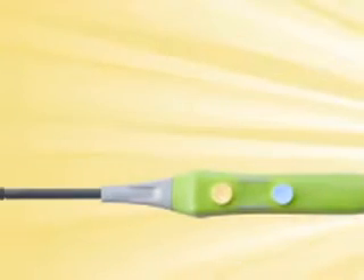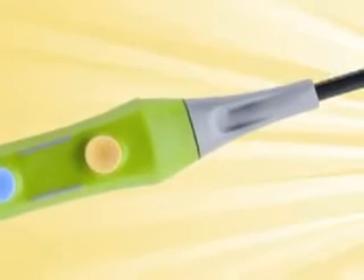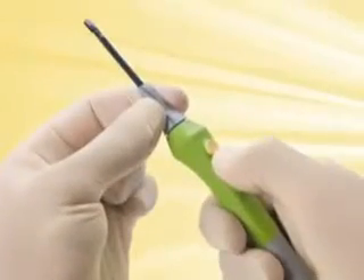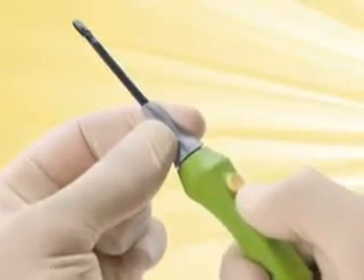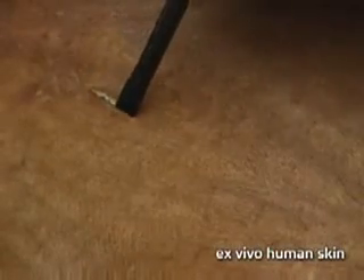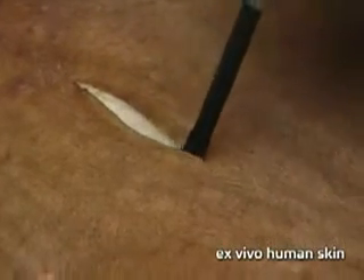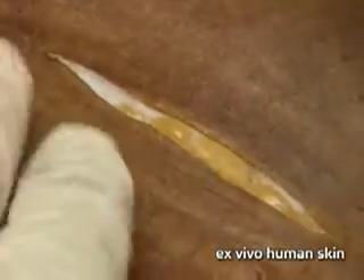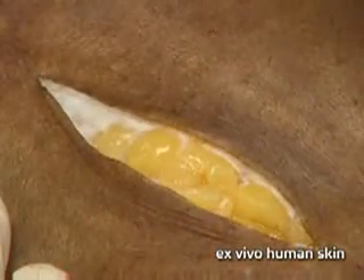Introducing the Peak Plasma Blade from Peak Surgical, a tissue dissection system that represents a quantum leap over surgical instruments in use today. The Peak Plasma Blade offers the precision of a scalpel and the bleeding control of an electrosurgical device without the extensive collateral damage, smoke, and char.